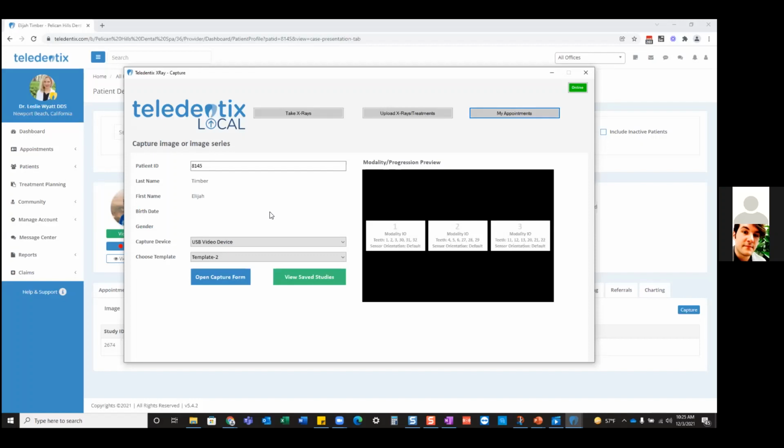I think those are great questions, guys. So I feel like we'll definitely address a lot of these also in the help portal. If you guys are familiar with the knowledge base, which you can all access through your Teledentix account, you can go to Help and Support right over here, and that's going to take you directly into our knowledge base, where you can look up anything that has to do with offline capture, with capture in general. But yes, worst case scenario, you don't do it, you can still capture by adding these appointments fresh.